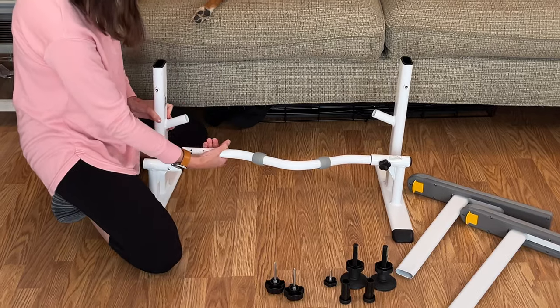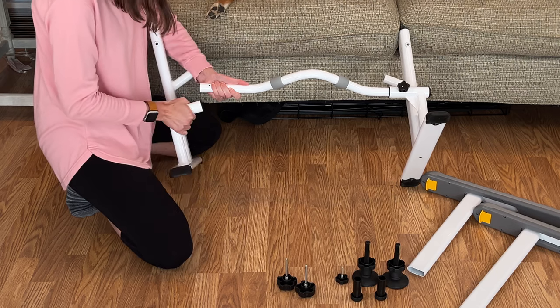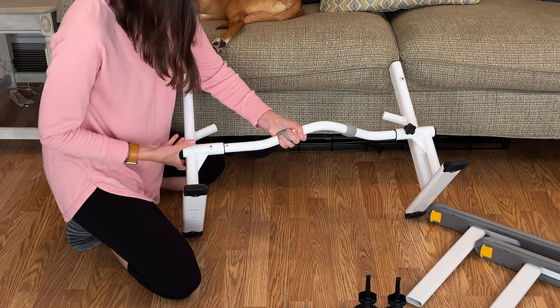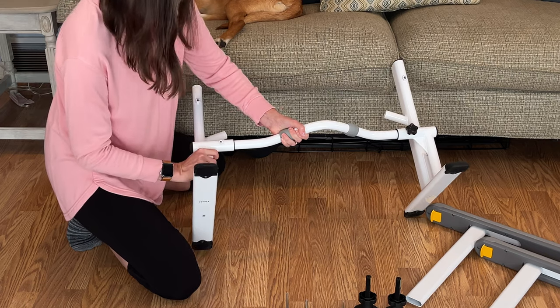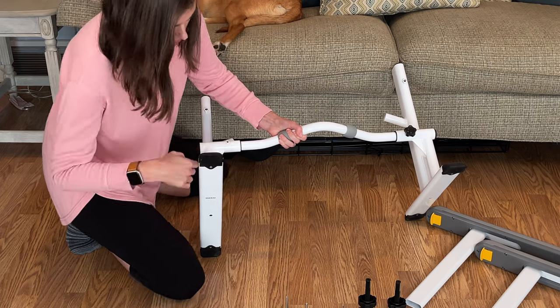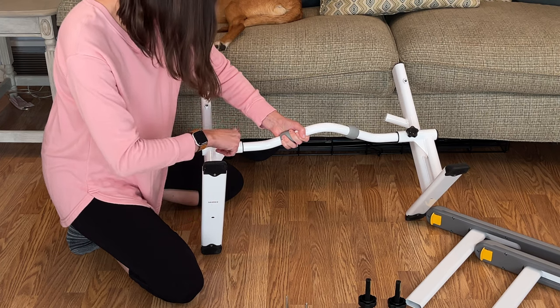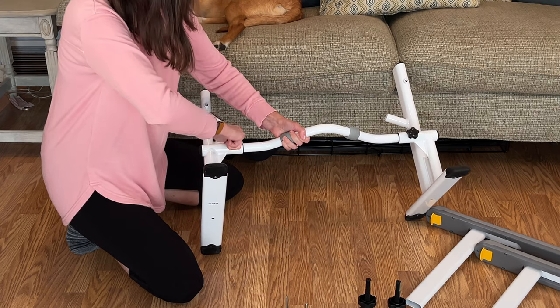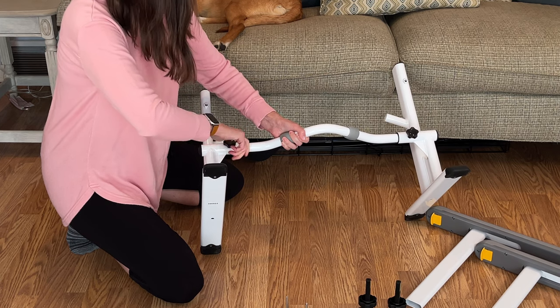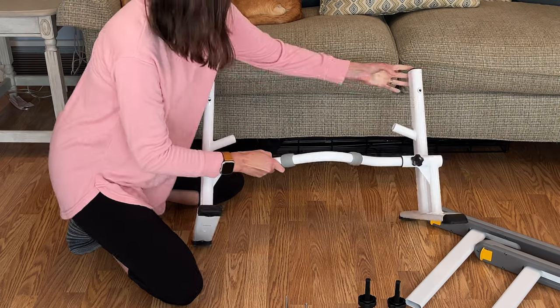And then we're going to do the next side. I find it easier if it's kind of tilted up so that I can see the holes. You're going to use the same bolt. Very, very easy. You want to go hand tight.